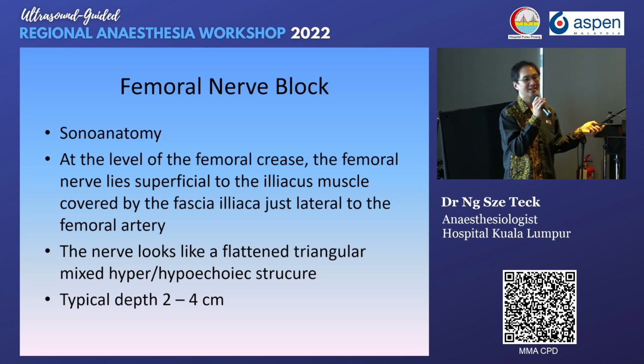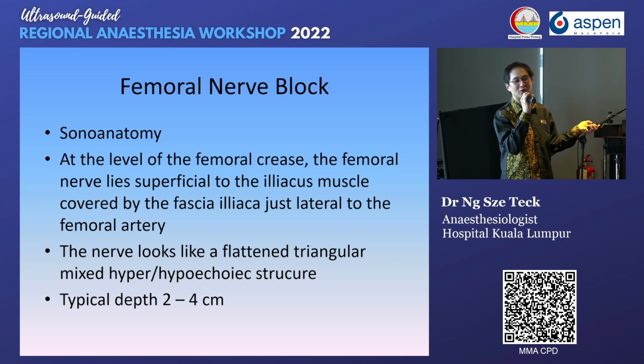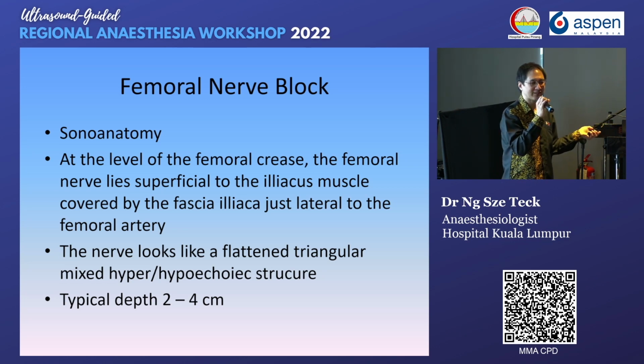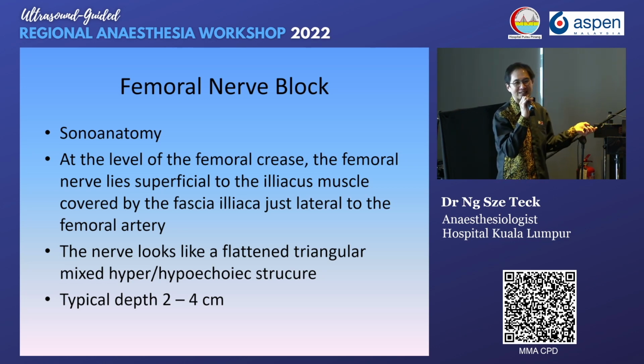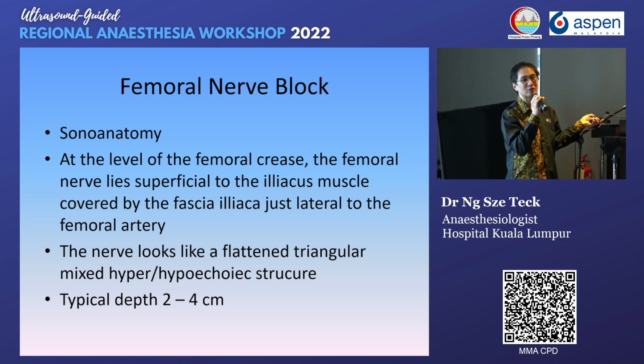Sometimes it's difficult to see the femoral nerve because it's a flat structure. It's difficult to differentiate from the muscle. Sometimes you can miss it. You can think that it might look like a fascia.